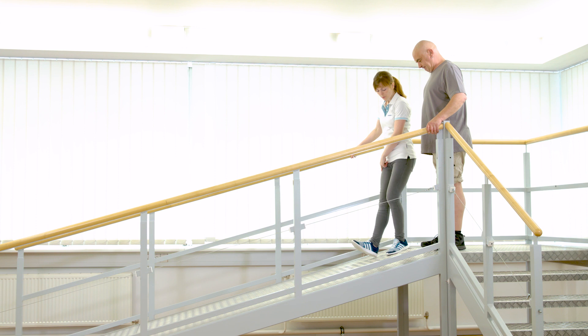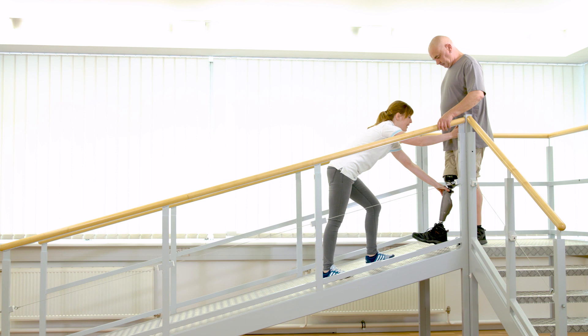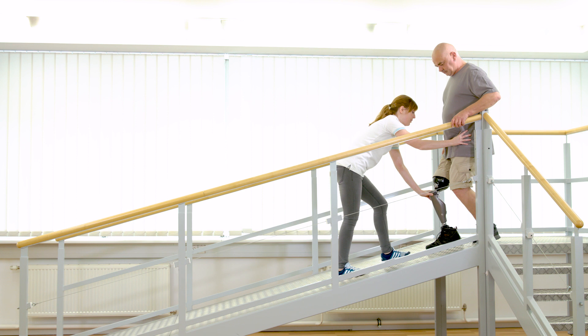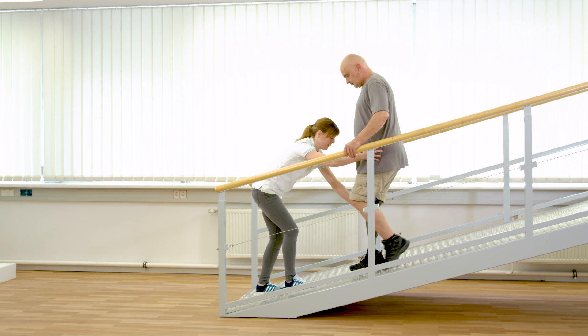Walking downhill on steeper slopes cannot be managed using the stance release. The yielding technique is used instead. By means of the stance flexion resistance, Gerhard walks over the bent knee. At first, he yields into the knee joint a few times so that he gets a feeling for the resistance. When the contralateral leg takes a step forward, Gerhard has to allow knee flexion on the prosthetic side and he rolls over the entire foot.